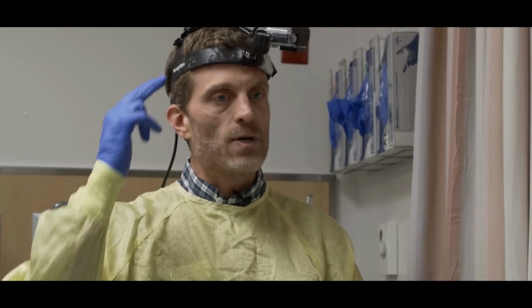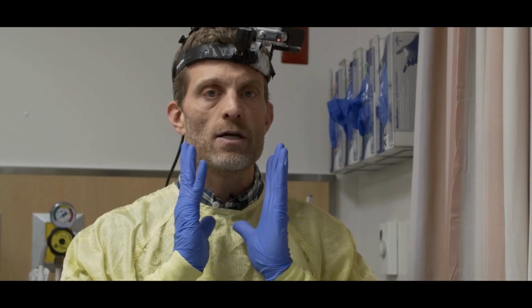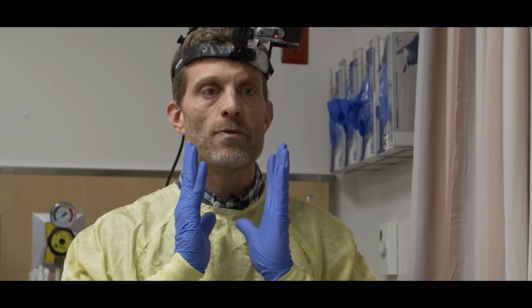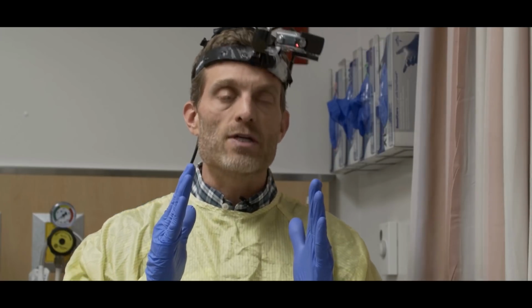Of course, the advantage of the procedure is this patient is continuing to breathe throughout. This patient has obstructing airway pathology. When we keep him awake and we keep his brain connected from here to here, he's imparting a lot of tone to the musculature that supports the airway, stenting it open as best as he can. And by not giving him any systemic medications, he will continue to do that.